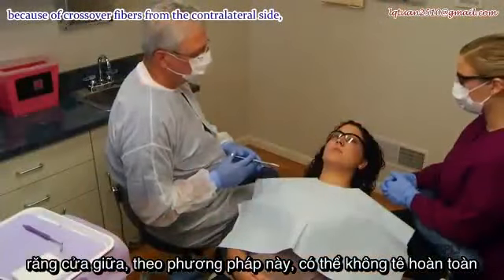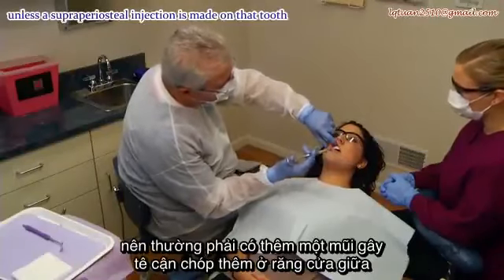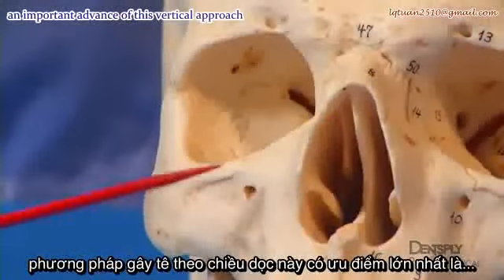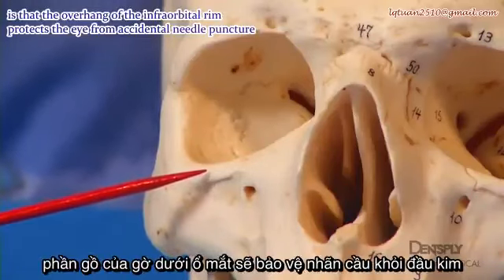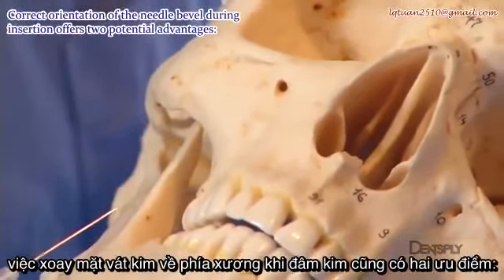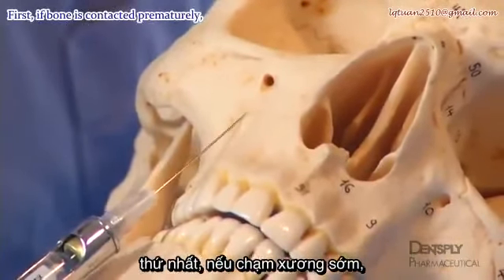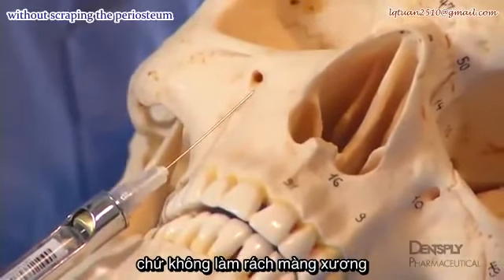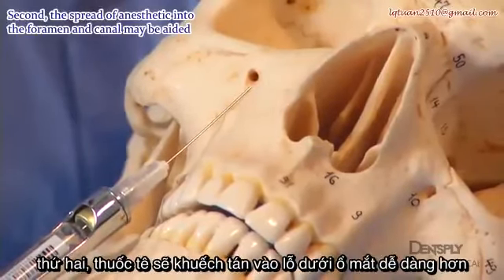Because of crossover fibers from the contralateral side, anesthesia of the central incisor may be incomplete unless a supraperiosteal injection is made over that tooth. An important advantage of this vertical approach is that the overhang of the infraorbital rim protects the eye from accidental needle puncture. Correct orientation of the needle bevel during insertion offers two potential advantages. First, if bone is contacted prematurely, the heel of the needle bevel will tend to glance gently off the bone without scraping the periosteum. Second, the spread of anesthetic into the foramen and canal may be aided.